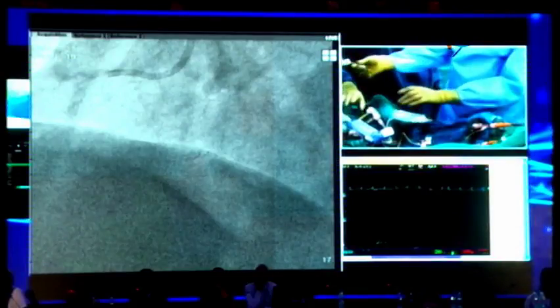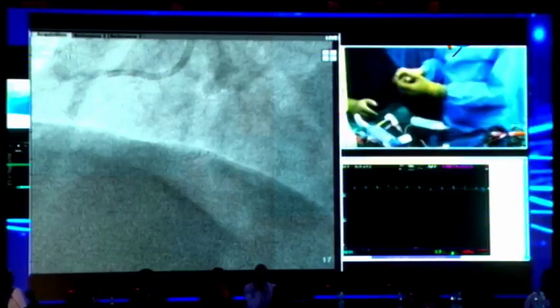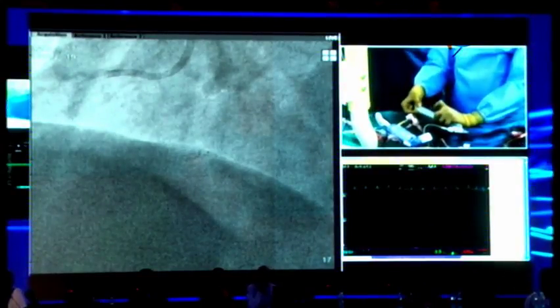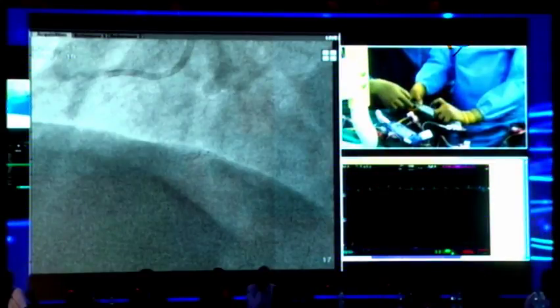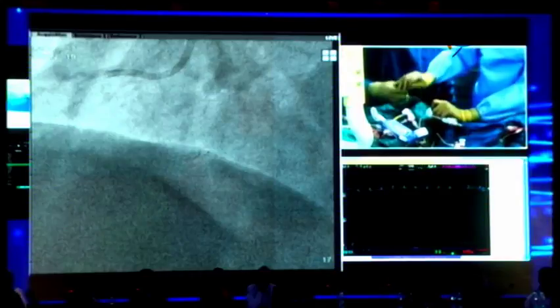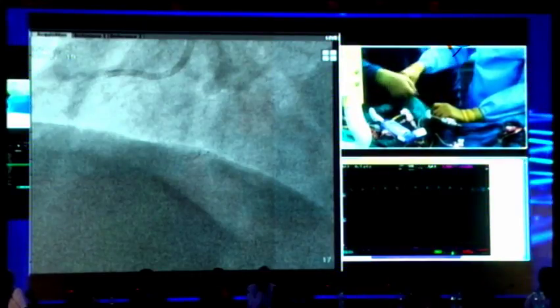Okay, so here's what I want you to do. So you're going to stick it with a stingray wire or some other wire? I'm going to have you use the stingray wire. Okay. Put it on here. Put it on here. No. Take it out. Okay. Let me show you. I'm going to pull negative, and then I want you to put it on here so that it doesn't. I want negative suction, right?